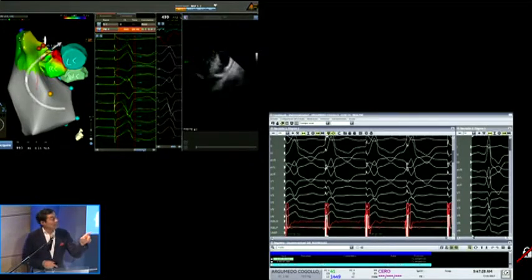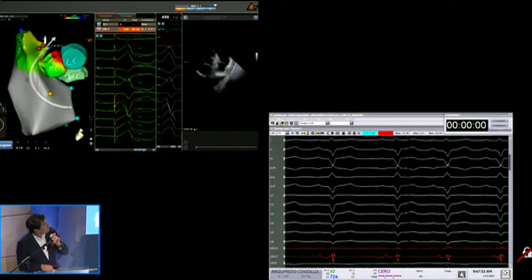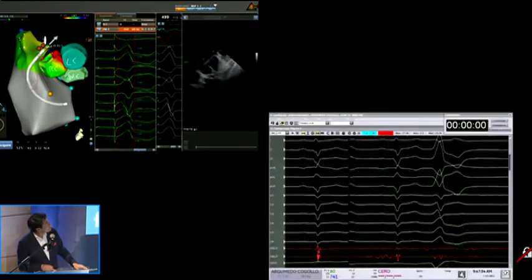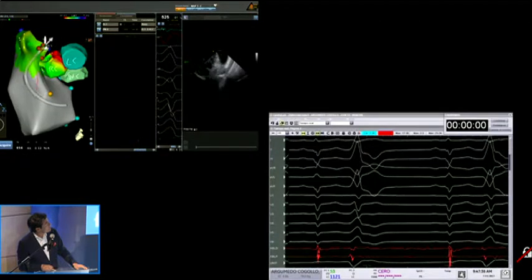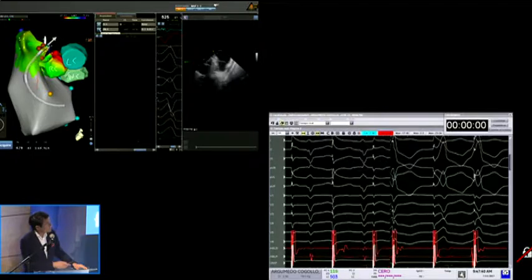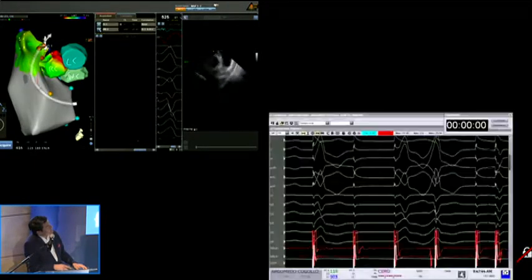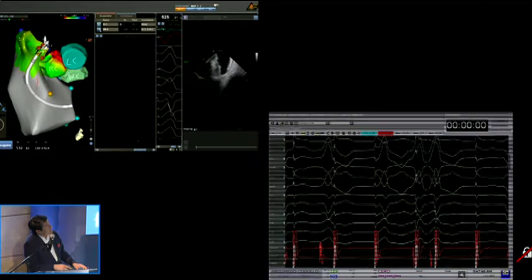Let us stop there. Stop there, Diego. Can we pace here again? Now there is capture. They lost it. There's no capture here. Capture here, Andrea.